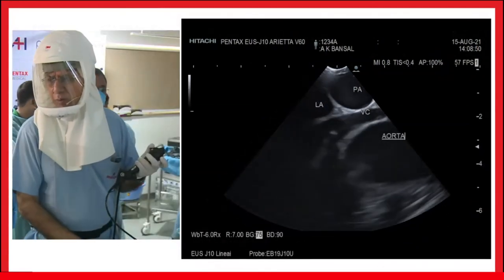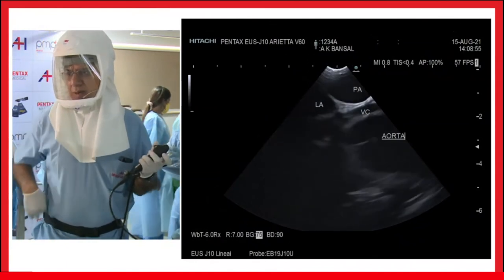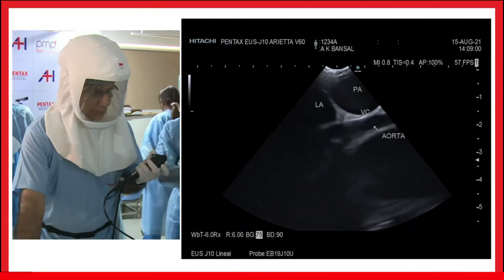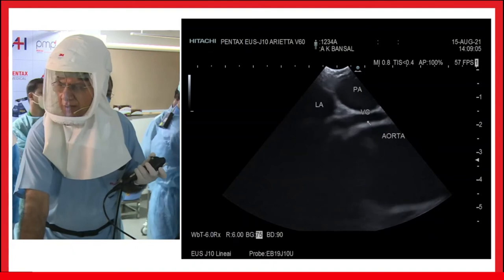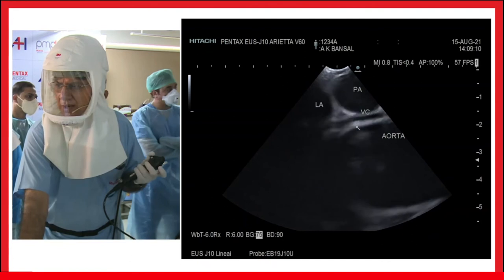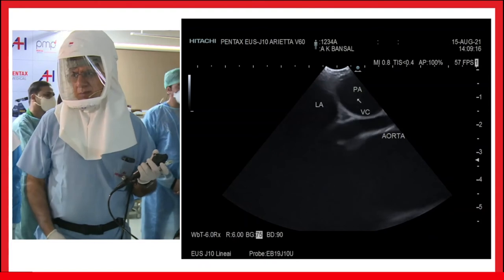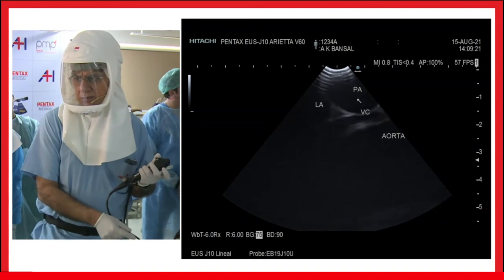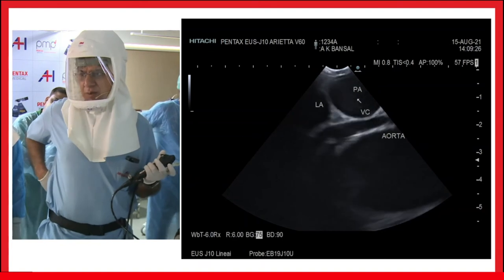And this is, mind you, the ascending aorta. This is not the ascending, yes. Have you injected the bubbles? Yeah, injecting, sir. Injected? So we will keep our eyes here. First, the bubbles will come into the superior vena cava, and then they will. Injected, sir. Okay, you can see they appeared first in the superior vena cava, yes.